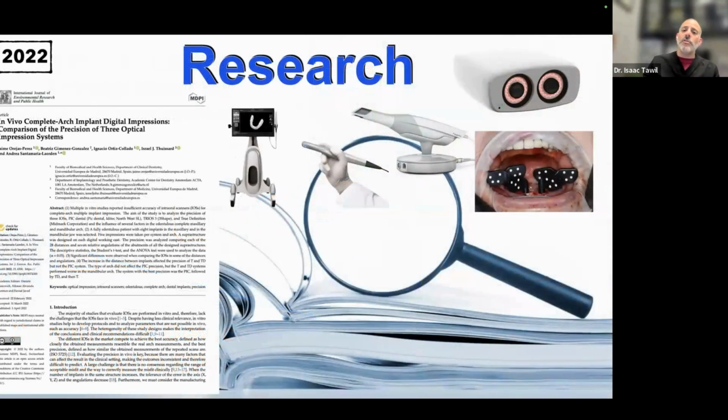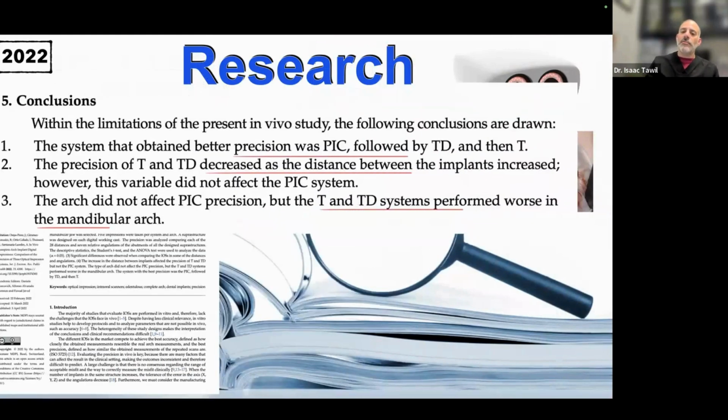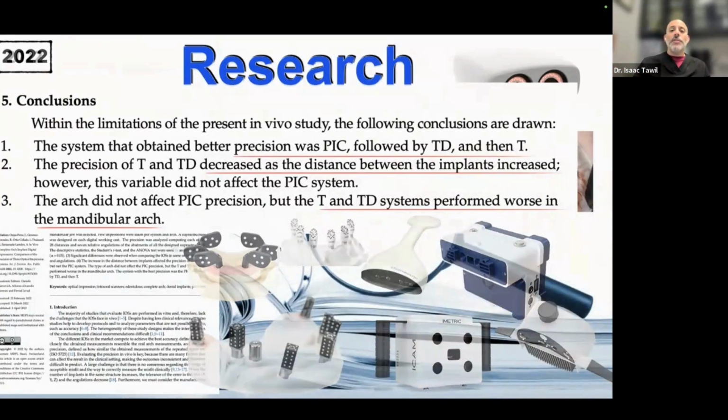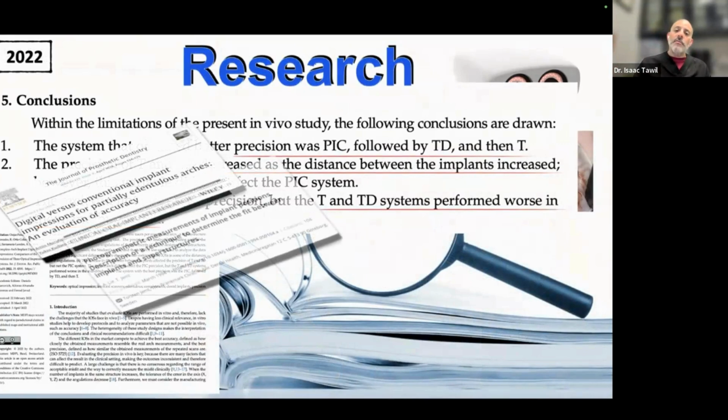When we look at the research, there is no doubt if you compare any of the scanners to photogrammetry, no matter which photogrammetric system you use, we are much more successful using these flag systems. Some of the flag systems, they're all vertical here. Some of them have more of a flag type, some have more of a domino type shape, but they utilize these two concepts, intraoral scanning and then photogrammetry, and then combining them together in a separate software. The research is undoubtedly there.